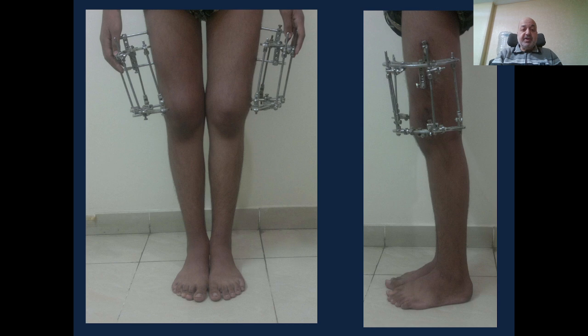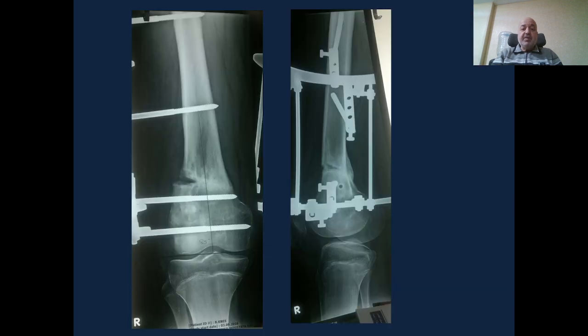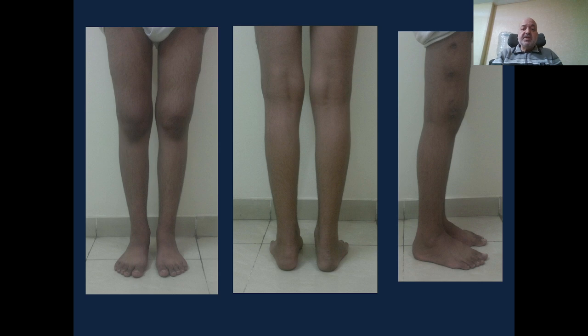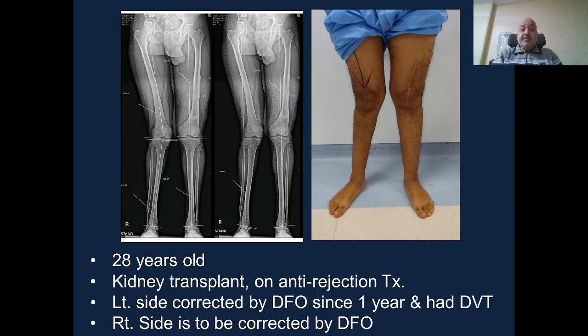This is a follow-up. After 2 or 3 weeks, the patient can usually stand up and start assisted walking. We remove the frame after full bone consolidation and after the patient is able to do the single leg stance test described by us and published before. In adolescents, the frame is usually removed after about 3 months, exactly 90 days. No cast is needed after frame removal. It can be removed as an outpatient procedure under intravenous sedation anesthesia.